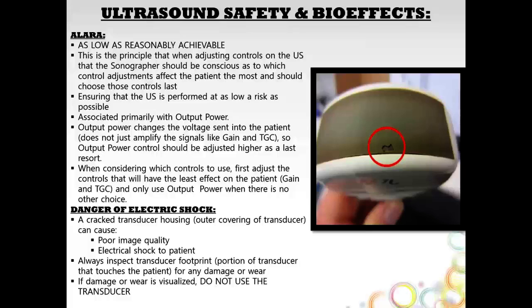And we want to always minimize to the patient the risk of thermal effects or non-thermal effects of ultrasound bioeffects. And even though the risk is incredibly low and we care about it more usually with the fetus, we always want to minimize to the patient any potential issues or problems that could happen. So when we're adjusting controls, we should always think about, does this control affect the patient? Does it affect the dose of ultrasound that the patient is going to get? If so, we want to use those controls sparingly and use controls more that don't have an effect on the dose of ultrasound to the patient.